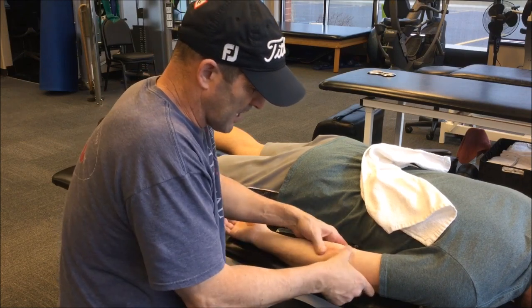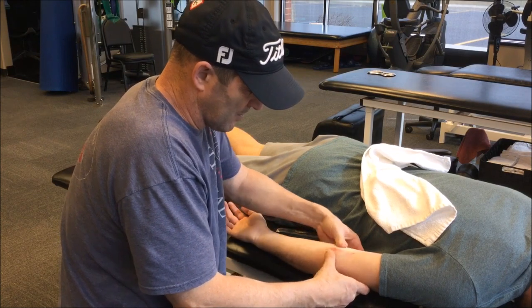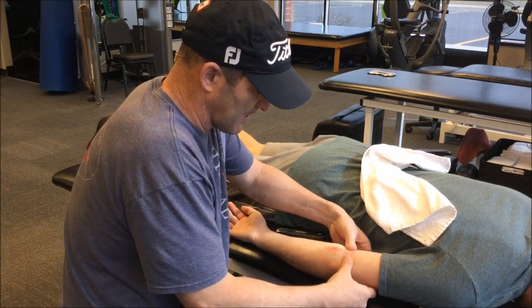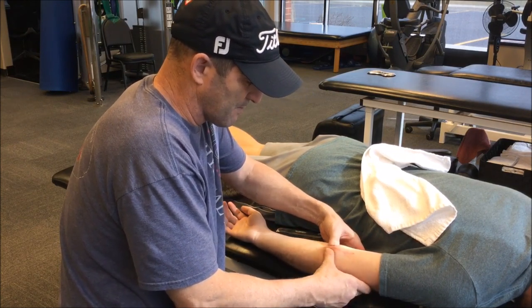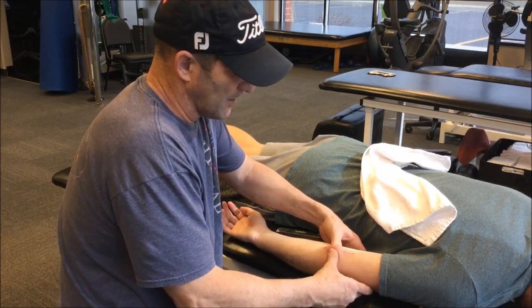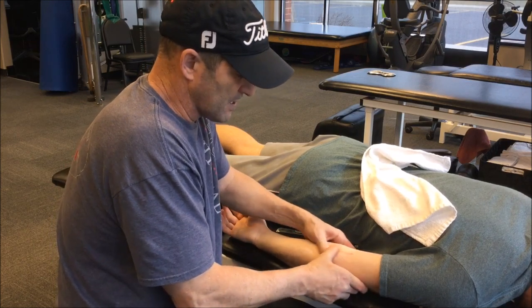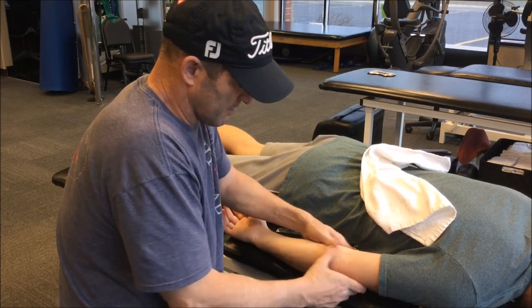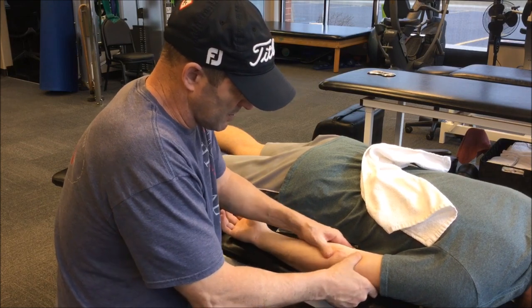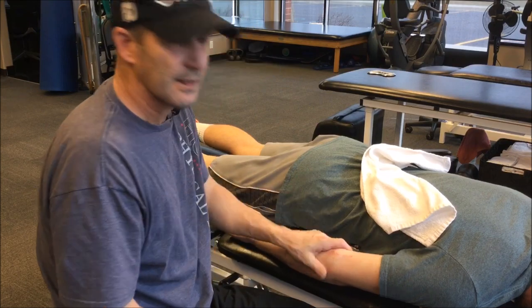When you work with your Tommy John athletes, you're constantly assessing and testing, and you're also trying to do everything you can manually to free up that scar so there's not even a remote possibility that they're getting held up by something that can be easily addressed and often missed in a clinical setting. Three Graston techniques that you can use to make you better as a clinician and help your athlete.